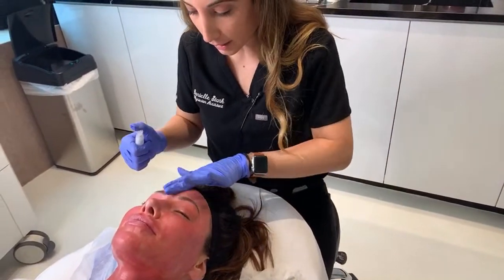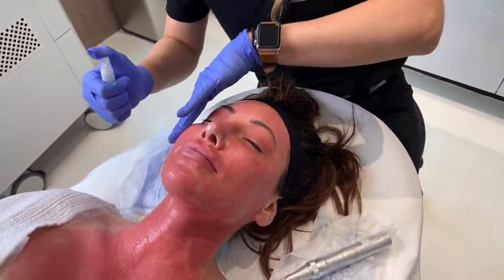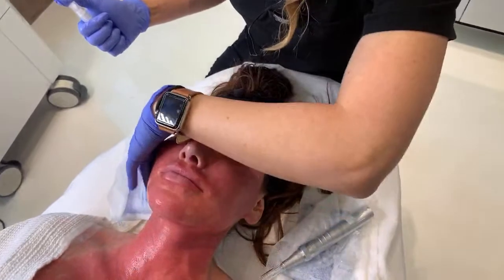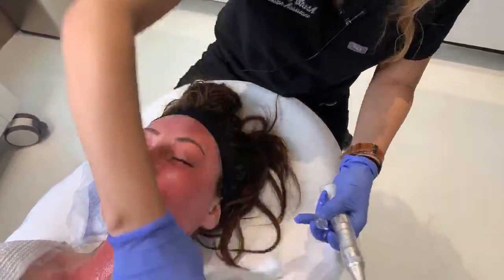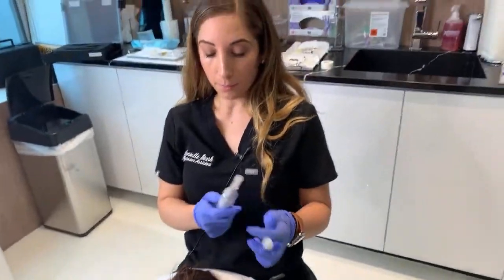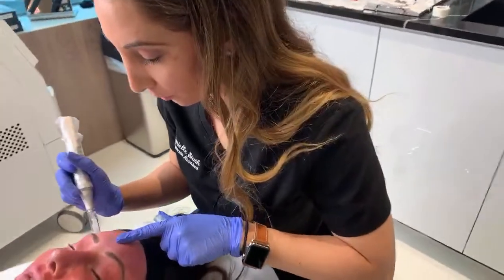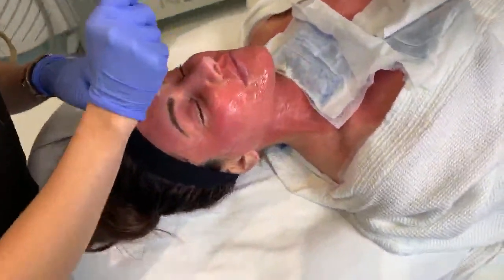So now what I'm doing is applying hyaluronic acid, and I'm going to just work on kind of two parts of the face at once. Hyaluronic acid is naturally found in your body. It's our body's hydrator. And so what it does, I'll give you a little ice pack right now. What hyaluronic acid does is it cushions our joints, and we've basically been able to extract that and formulate it. Tell me if you're okay. We've been able to take that and use it as a very, very popular ingredient in our aesthetic practices.